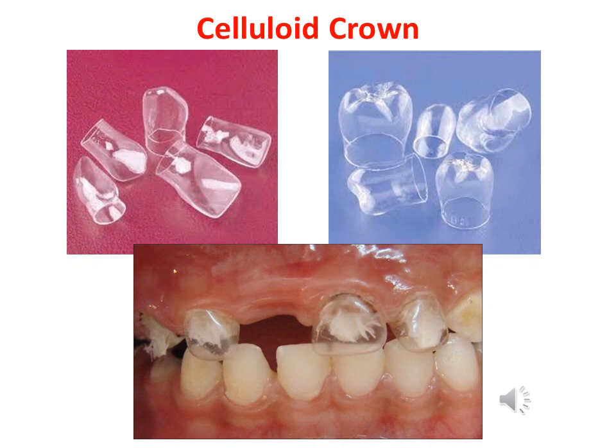Here sometimes when we have a complete destruction to the crown of the tooth, we use what's called a ready-made celluloid crown for the application of the composite resin. We do manipulation to the celluloid crown, يعني ممكن ناخذ الكراون ونقصه ونعمله ونرتبه بحيث يجي عندنا to fit the missed crown of the tooth.